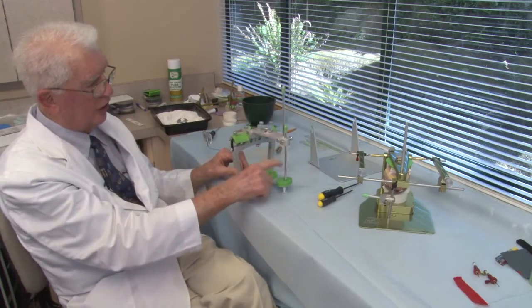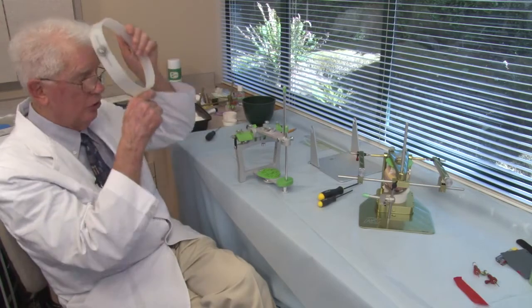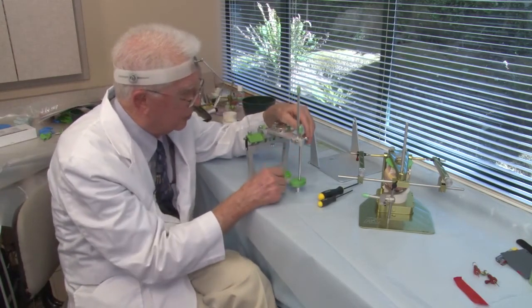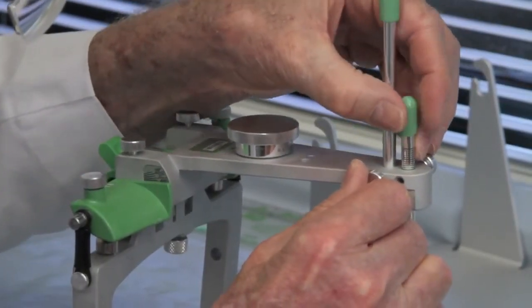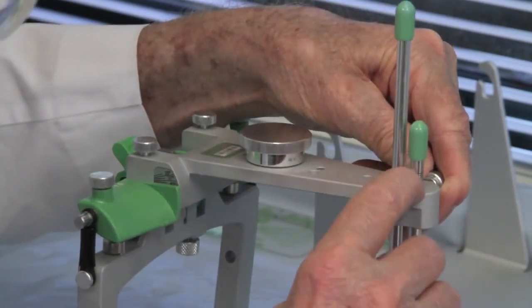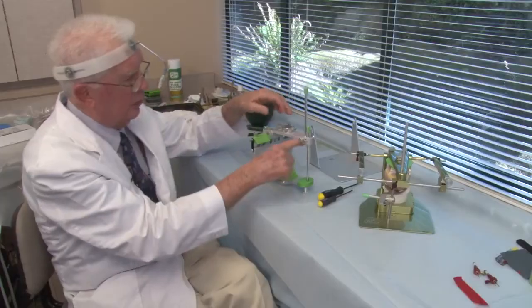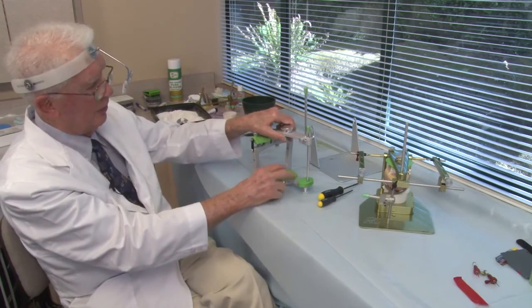So we want to actually elongate this pin here. And I've standardized it so that I always use plus 3 millimeters to mount all my lower models. So the red mark you see on the incisive guide pin there is at plus 3 millimeters. So I move that anterior pin so that the red mark is even with the top of the articulator. So what I've done is increase the distance here by 3 millimeters at the pin. And we'll be ready in a moment to mount our lower model.